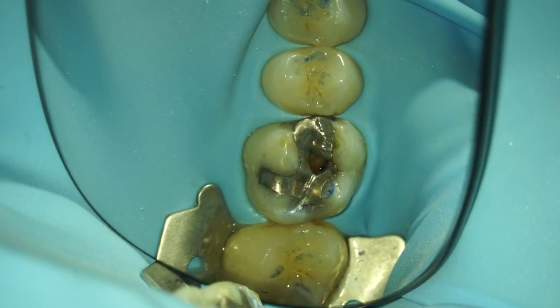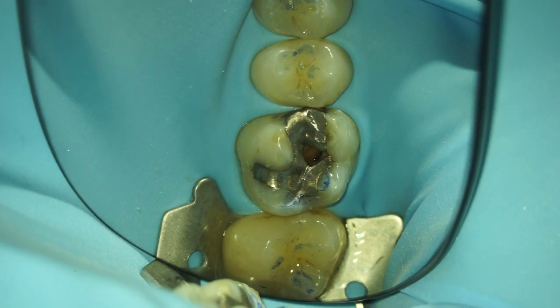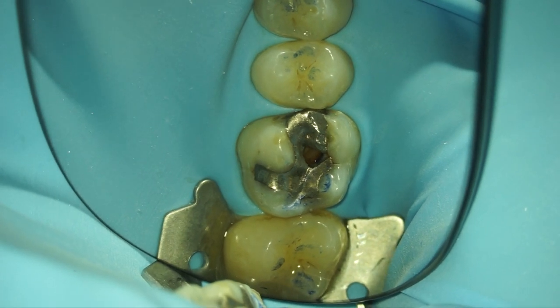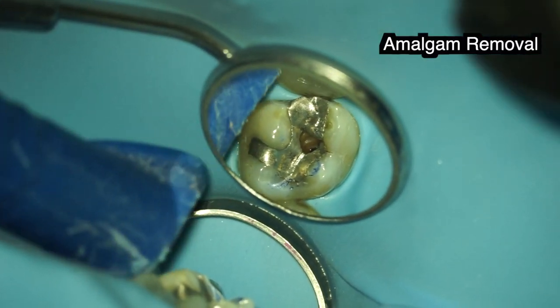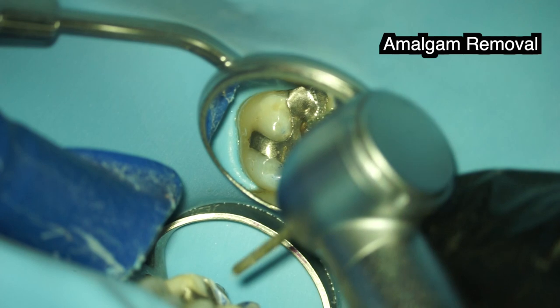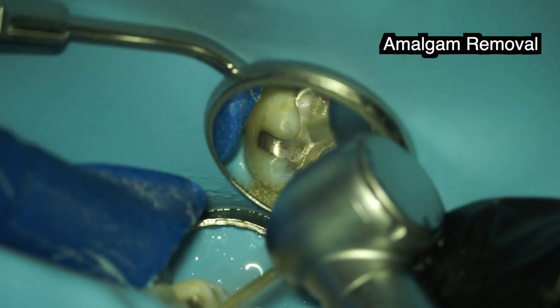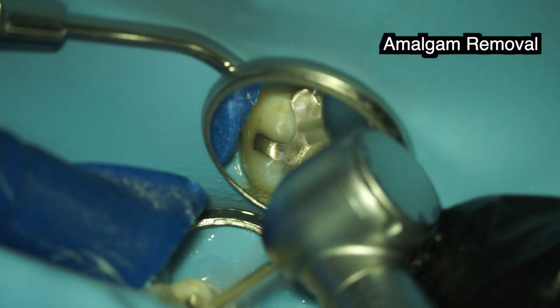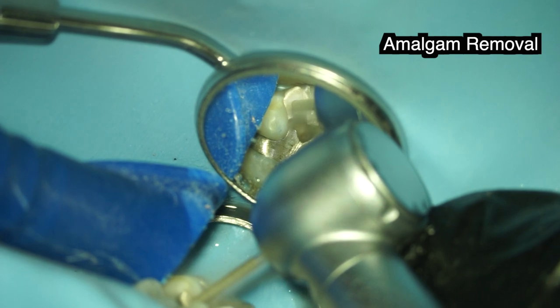As you can see, the teeth are isolated with a rubber dam, which is essential to place a good new filling. Okay, let's get started. First off, we need to remove the old metal filling. Notice that I try to remove the material in as large pieces as possible. Throughout this video, I am going to speed up parts of it in order to keep the length of the video to something watchable for you.